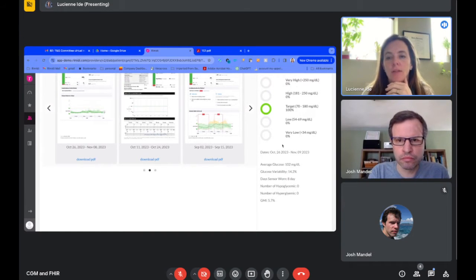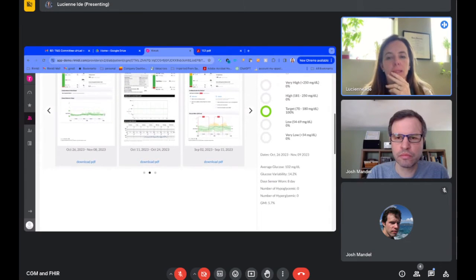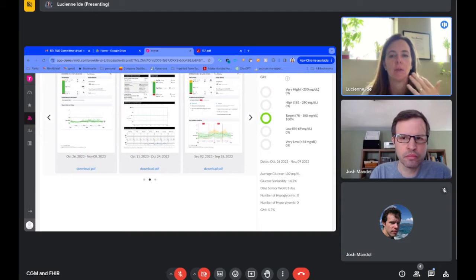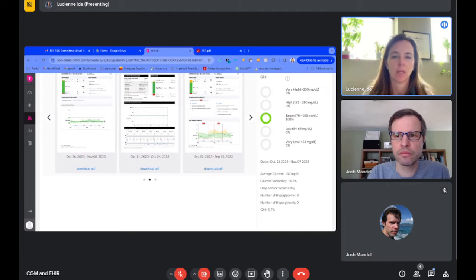So we're getting all of these as discrete endpoints, and that's pretty common between the CGM platforms. Meaning what we get from Dexcom, what we get from Abbott, what we'll get from this new partner are all pretty much the same. And then the nuances are Abbott does not share discrete data or timestamp data, as they call it, meaning all of the readings.